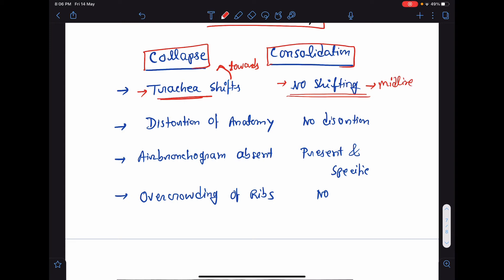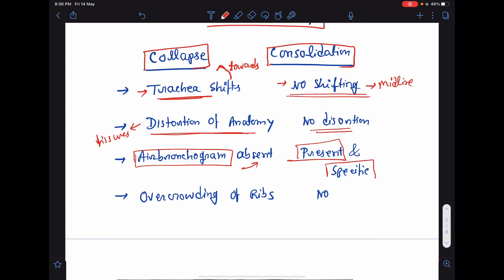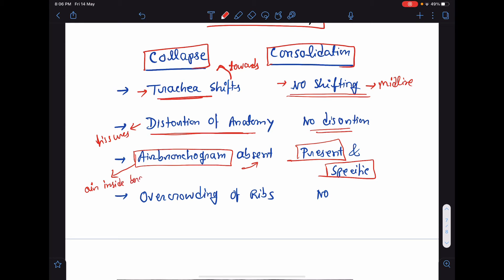In collapse, there will be distortion of anatomy of the lung and distortion of the lung fissures. But in consolidation, there is no distortion of the lung architecture. If you talk about air bronchogram, air bronchograms are usually absent in collapse. They are present and very much specific for consolidation. Air bronchogram means air inside the bronchus or bronchi. In cases of consolidation, we will be able to visualize the air bronchogram, but in cases of collapse, we do not see any air bronchogram.